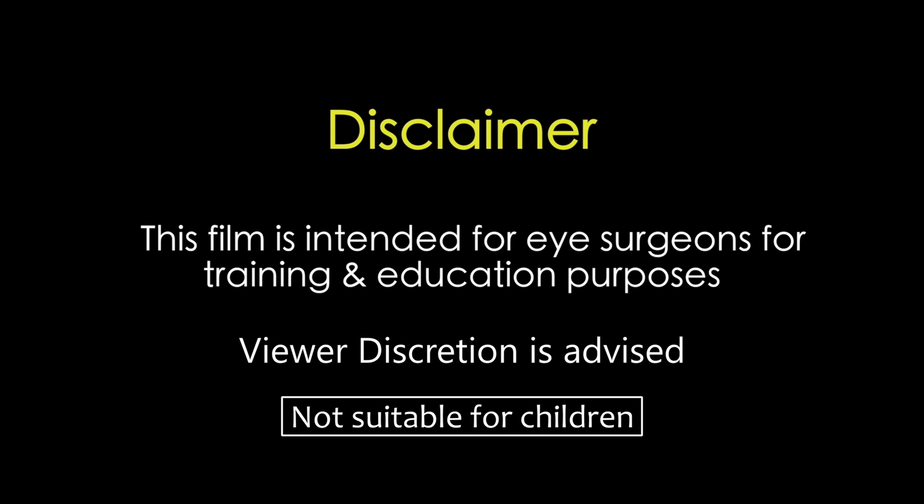This film is intended for eye surgeons for training and education purposes. Viewer discretion is strongly recommended.